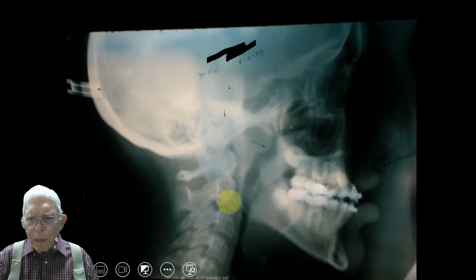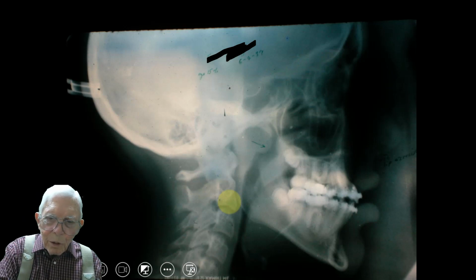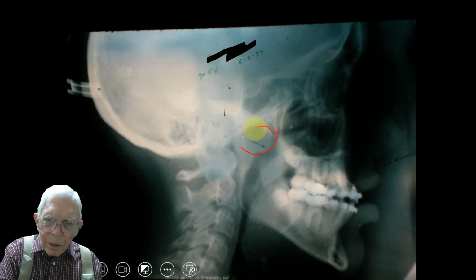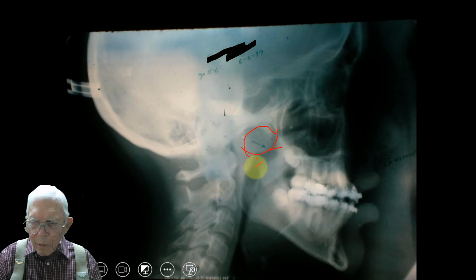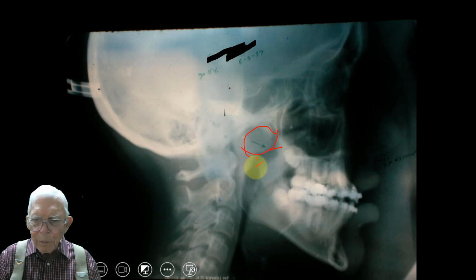All right, now this cephalometric shows you what a big adenoid tissue this young lady had, and you need to get that thing out of there and open this airway and get them where they breathe properly. And we, of course, send that ENT guy to take care of that, and maybe take the tonsils at the same time. I don't remember exactly, but we clear the airway in that respect.